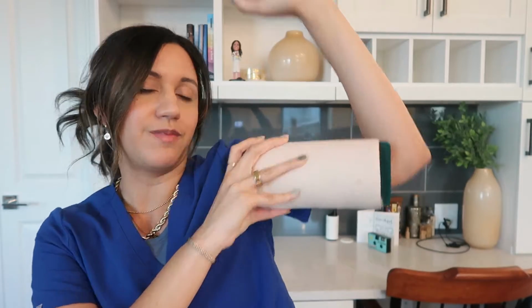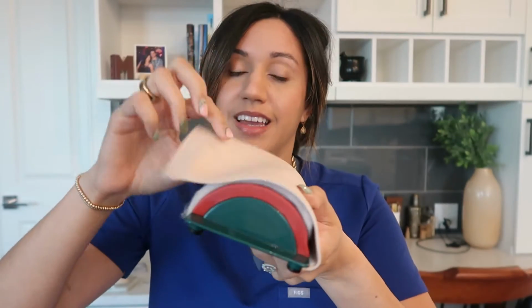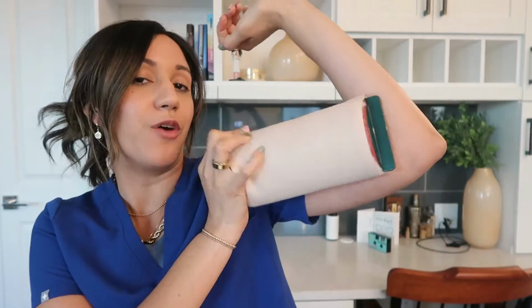Now for this video, I'm going to be using a prop. This right here is going to simulate the arm, or this portion right here. Now I'm going to take this apart really quickly so I can show you the different layers. So picture this top layer obviously as the skin, this white fuzzy layer as the fat, and then the red layer as the muscle. So let me just adjust this again. And again, remember, this is going to pretend to be our arm.